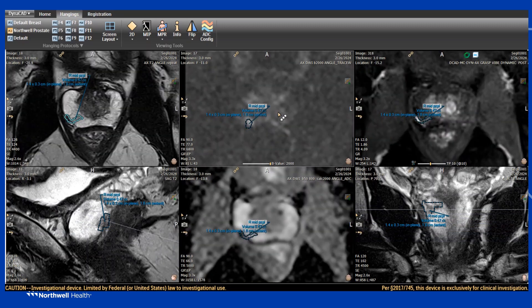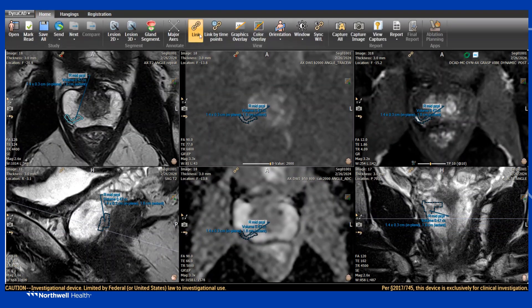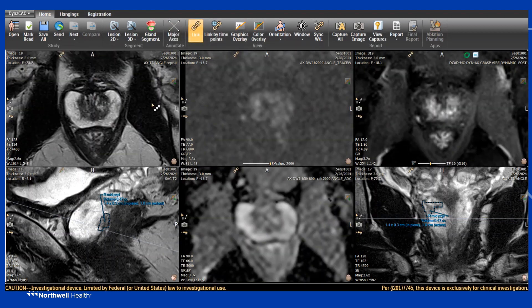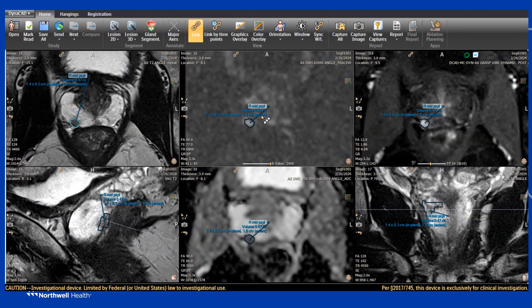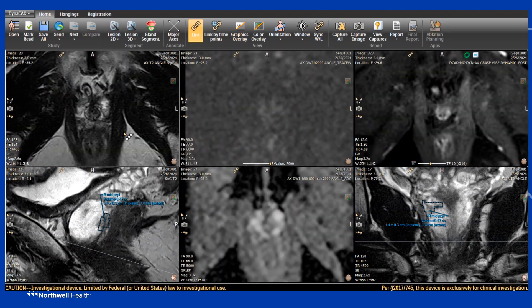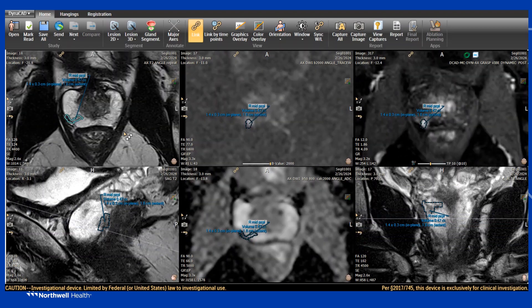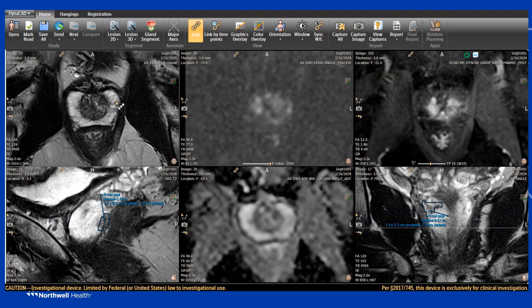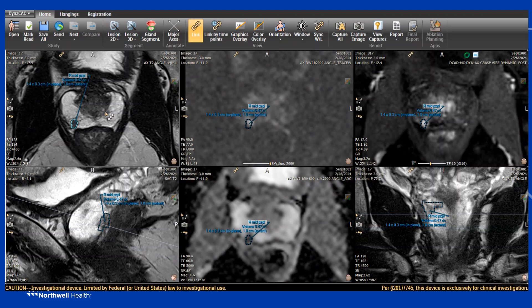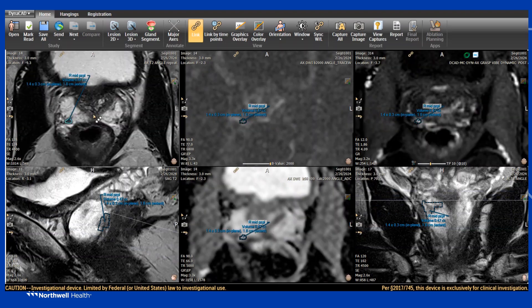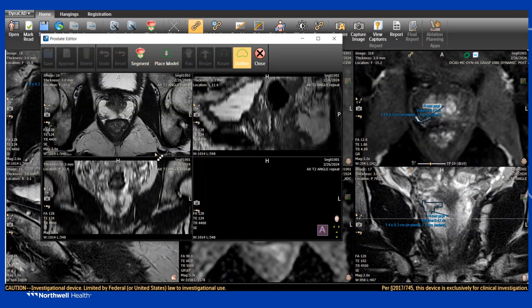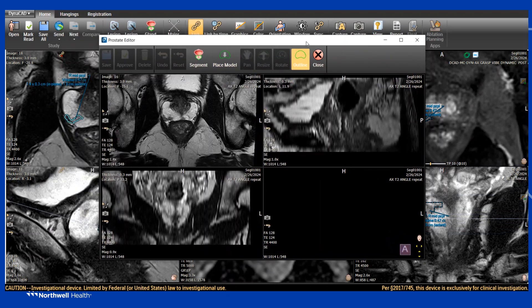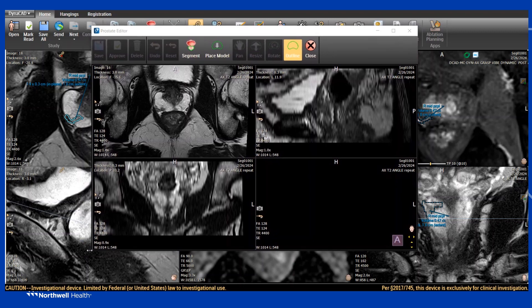Scrolling through the scan, I typically use the middle screen — the diffusion-weighted imaging. If your screens don't scroll together, see this link button? You can turn it off so they don't link, or turn it on to link them and look at the whole scan together — very helpful when reviewing cases. Now let's discuss segmentation and go over some basic anatomy. The white tissue around here is the peripheral zone with high signal. In the center is the transition zone. That dense spot up here is the central zone extending into the seminal vesicles. Let's click Gland Segmentation, and this window will pop open.